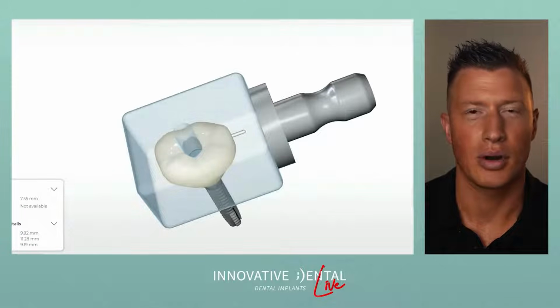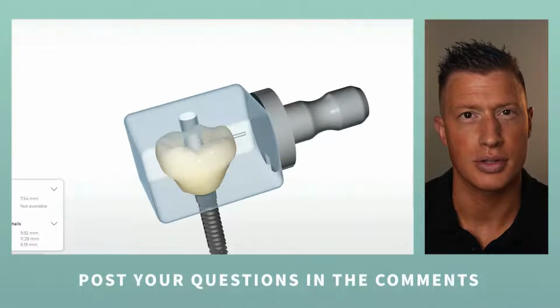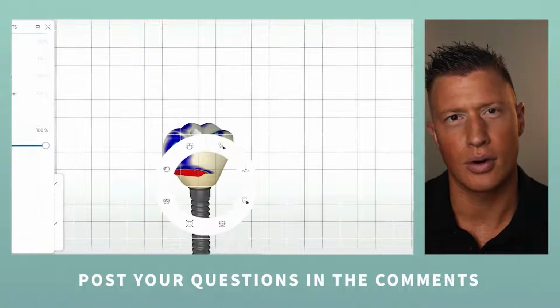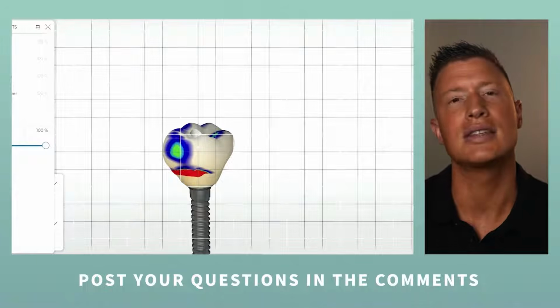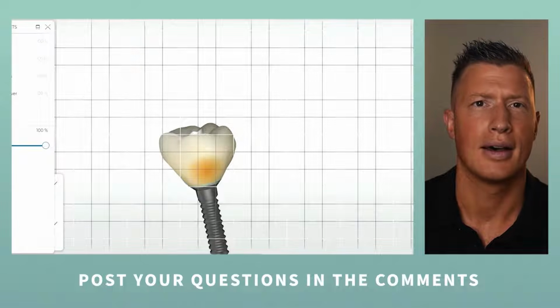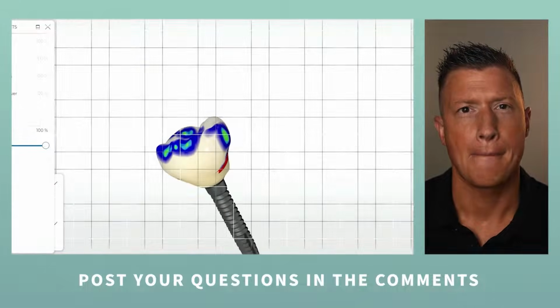So now we're ready to send it to the milling machine and mill it out of this block of high strength porcelain. So that's the next step. We're going to make it, and it'll be ready in a few short minutes, but it'll wait for months until we put this one in. Now, if this is a front tooth, we would be making this same day and putting it in same day, and then we'd keep it out of bite. That way the patient wouldn't be able to chew on it and put too much force on an implant that's trying to heal.